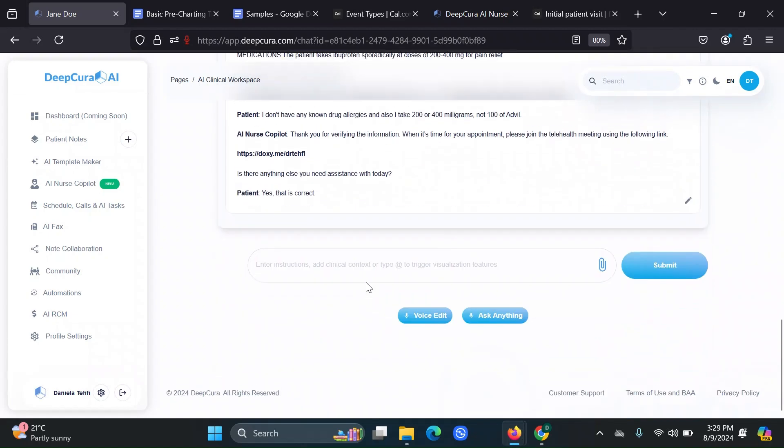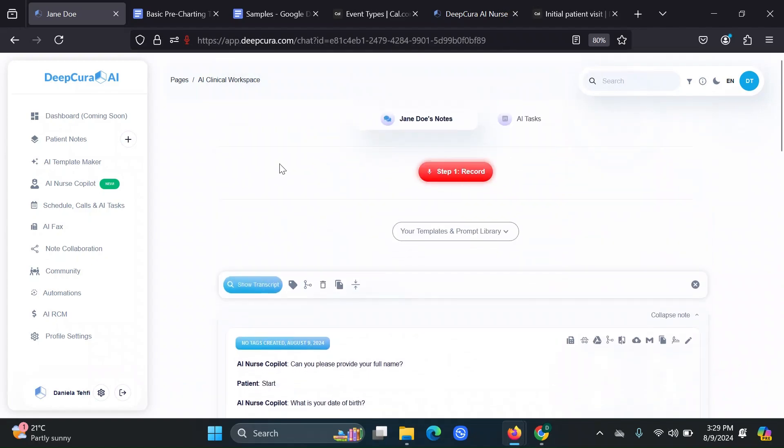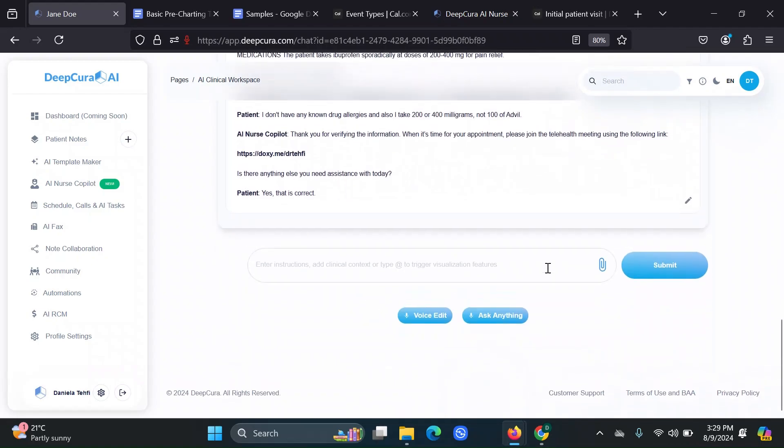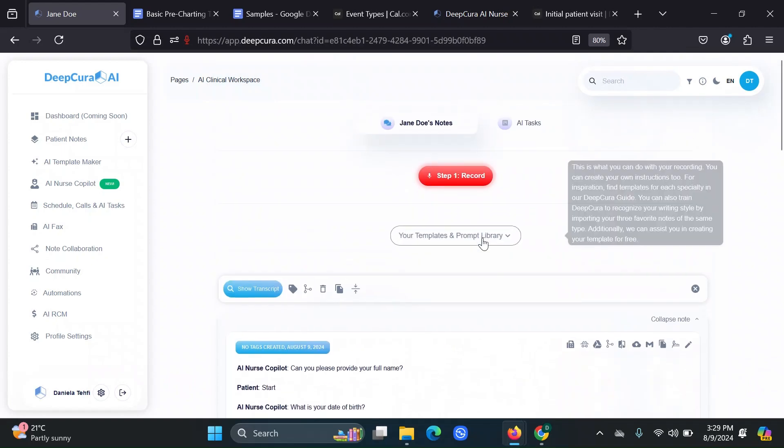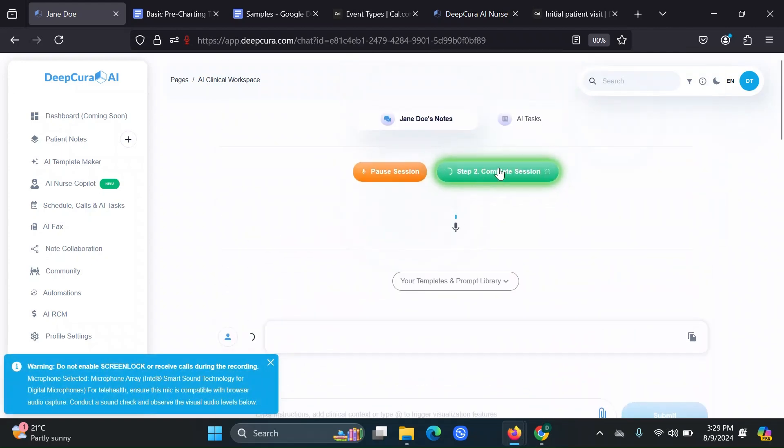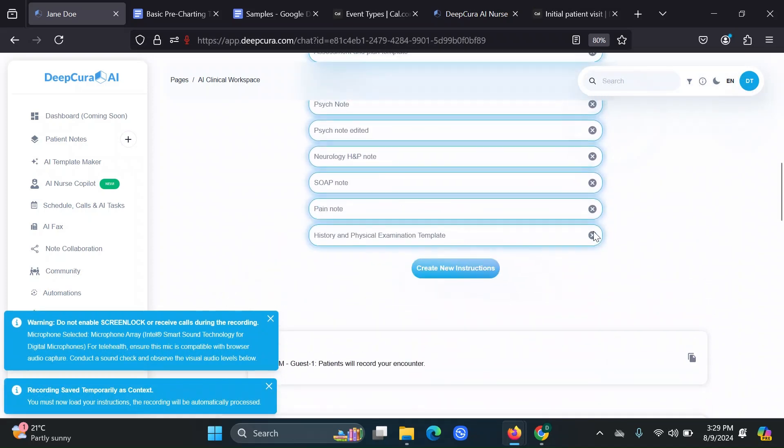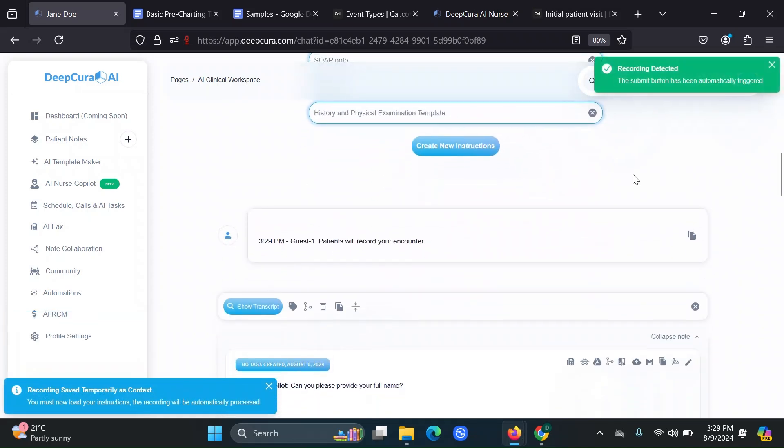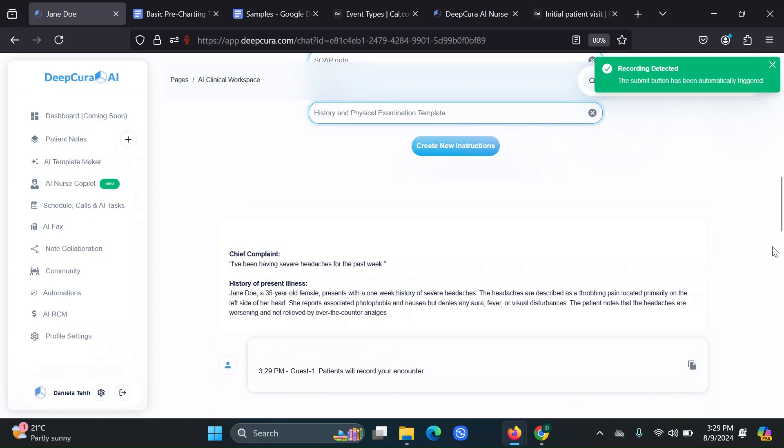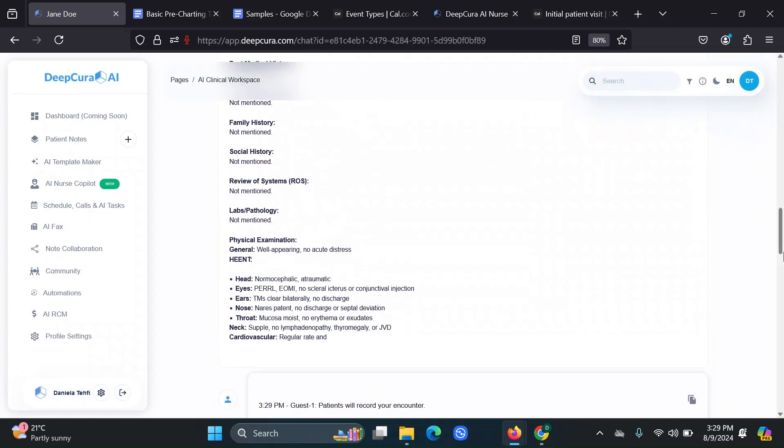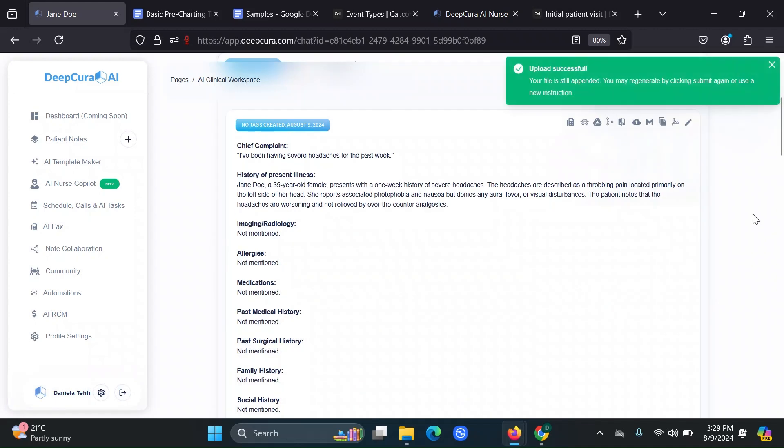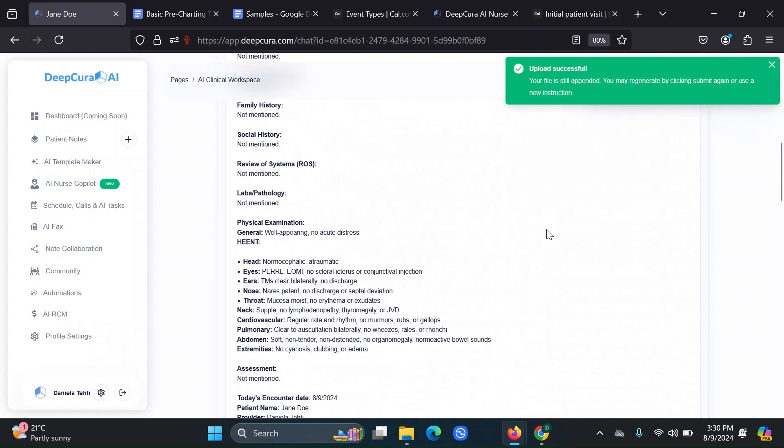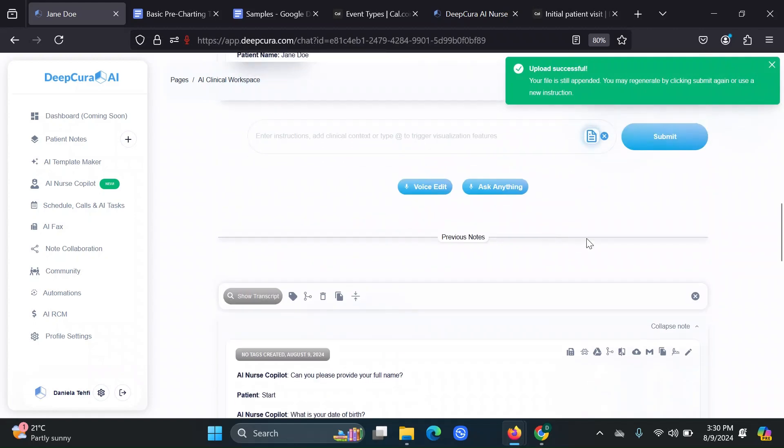After this, when you actually see your patient, you can go to where this AI nurse copilot note was transferred. Then do the interaction with your patient. So record your encounter, complete your session, click on your templates that you want to use for that note.